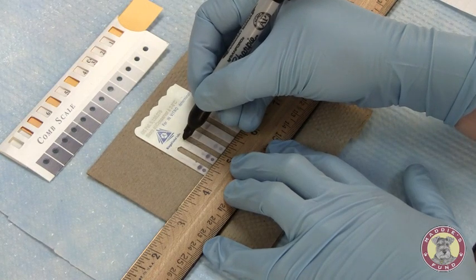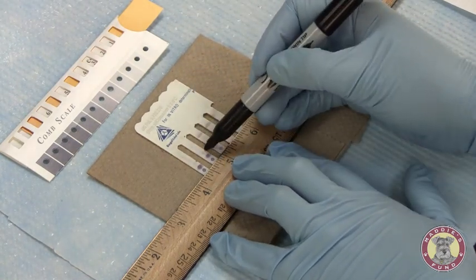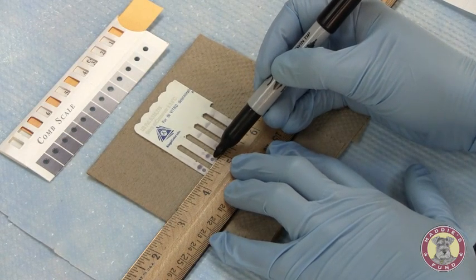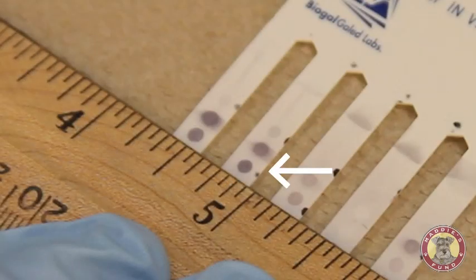Looking at sample 2, loaded in the second tooth — again we're always comparing to that positive reference control. The sample is very dark and it looks similar to the result from tooth number 1. Again, we will call it a 6.